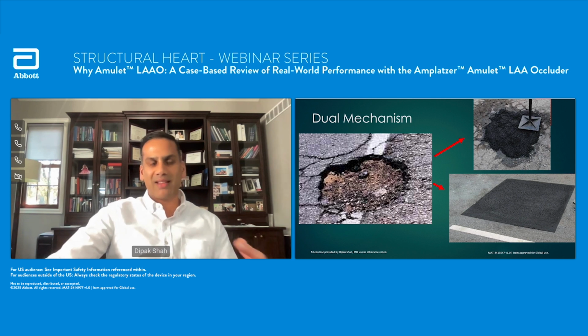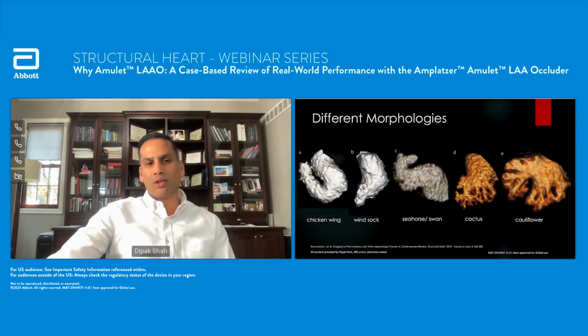Or if you give it a little thought, and I know Dr. Shah mentioned the CAT scan, really thinking about how you're going to deal with this, you could plug it and then with another component really seal it up. I think the bottom repair is going to last a lot longer, with less erosion and another pothole. So that's what I like to think about with these dual closure devices.